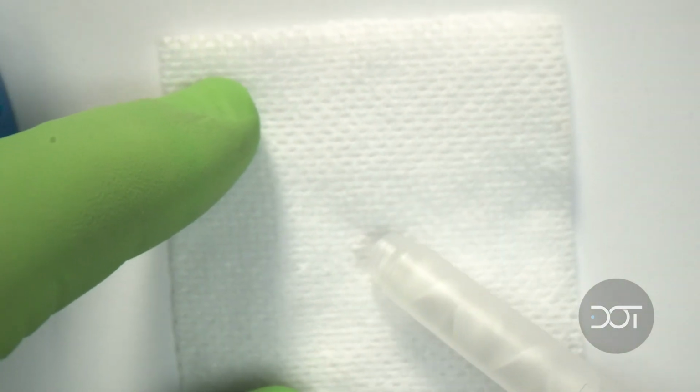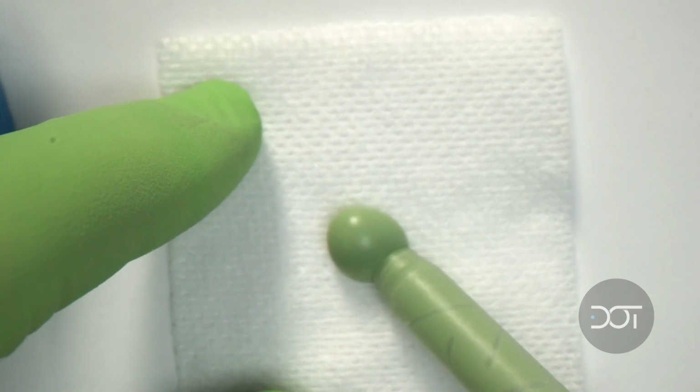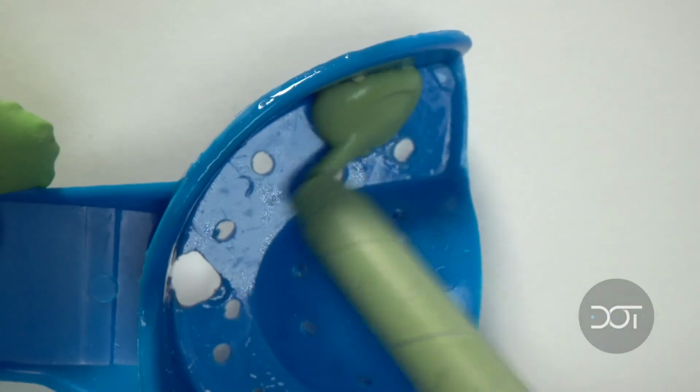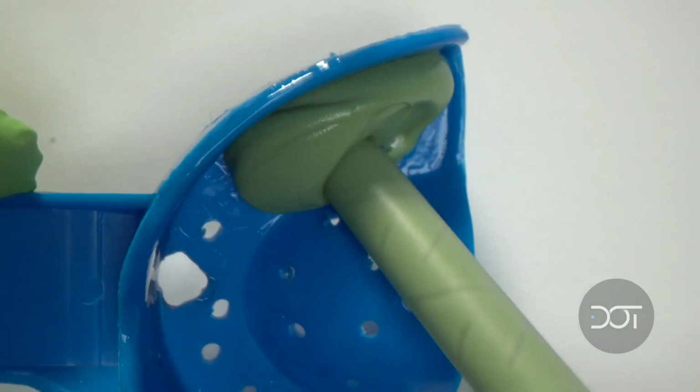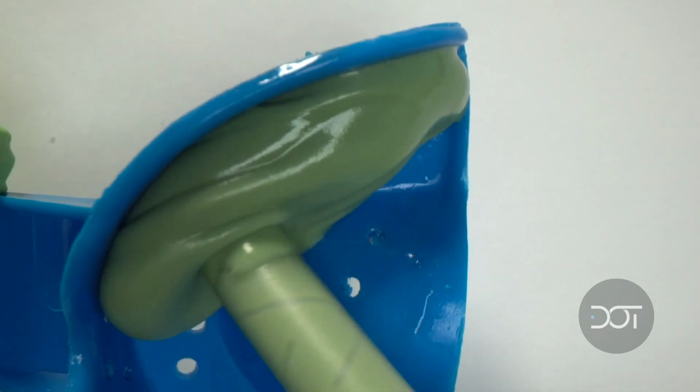I'm going to start my heavy body material. Make sure you bleed the material to make sure that it's running evenly. And now I'll load the tray. Now this material is Aquasil from Kerr. And you can see it's nice and stiff.